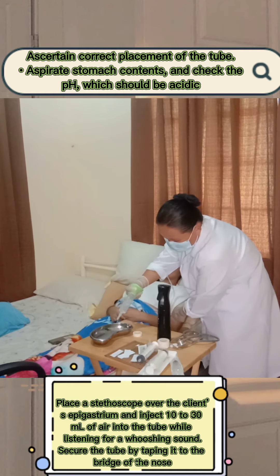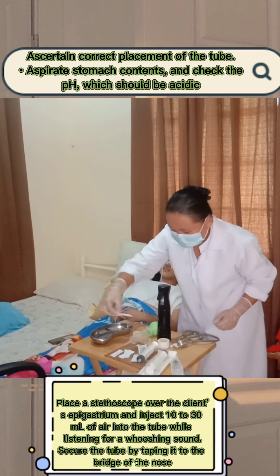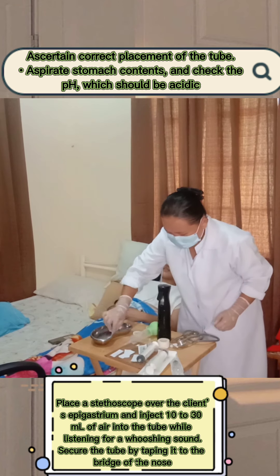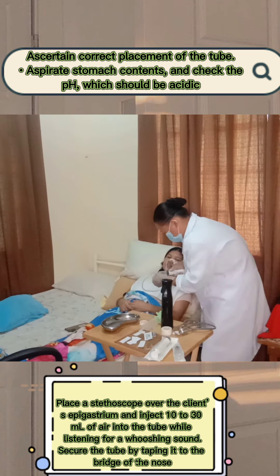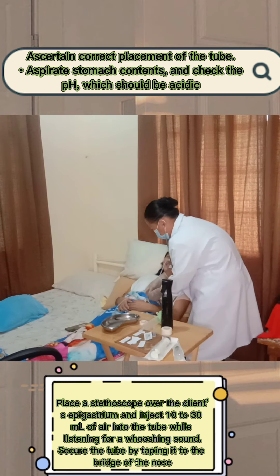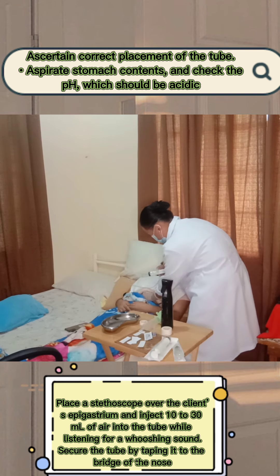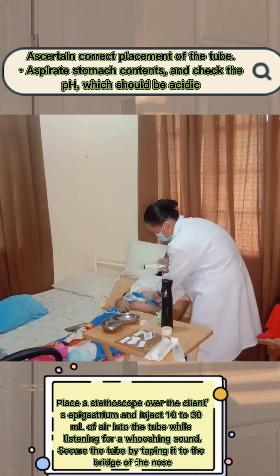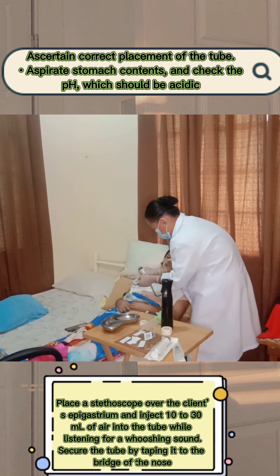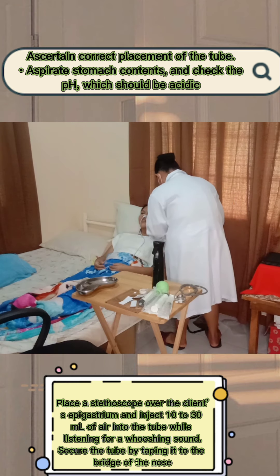To verify correct placement of the tube, aspirate stomach contents and check the pH, which should be acidic. Next, confirm by x-ray. Then place a stethoscope over the client's epigastric area and inject 10 to 30 ml of air into the tube while listening for a whooshing sound. Secure the tube by taping it to the bridge of the client's nose.